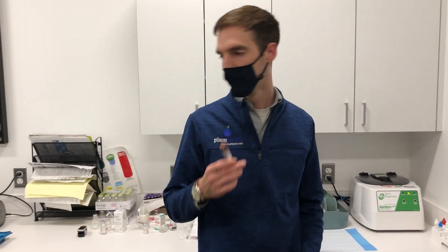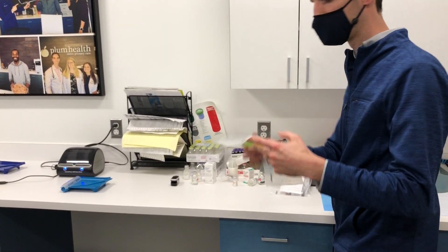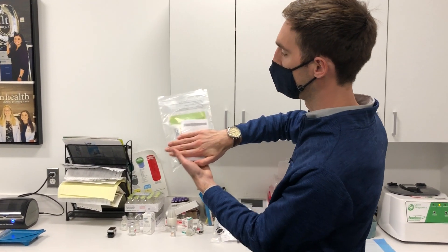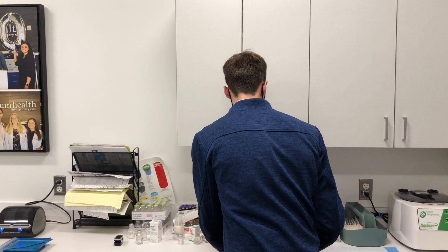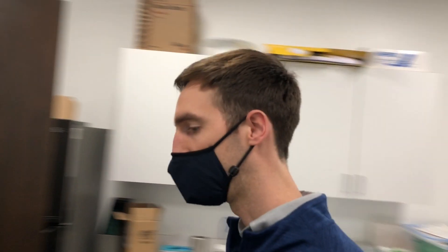Once that's labeled, we put it into one of these Quest bags that we keep here — drop it right in the Quest bag. Then we print off a cover sheet with a barcode so you can't see any of the patient information, but you can see our barcode. It has our Quest number on there that goes on the back of the box at the back of the office.